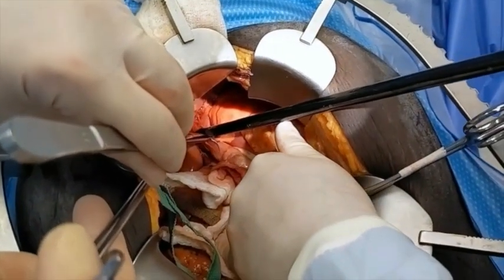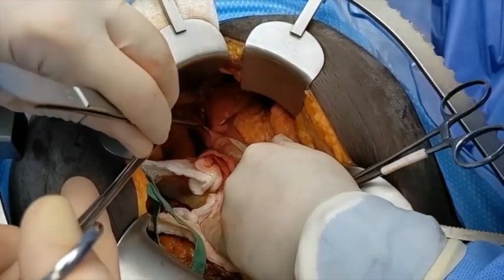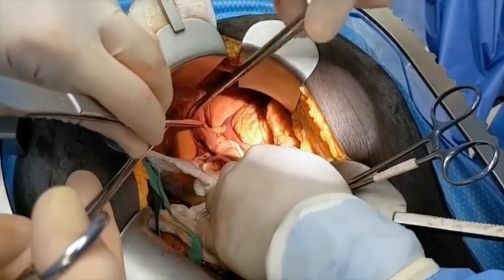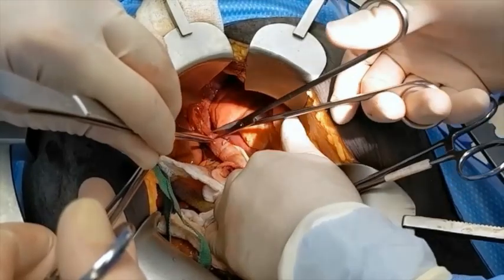of the diaphragm. The anterior vagus is carefully exposed and dissected off the distal esophagus for at least 2 to 5 centimeters. The vagus is then clipped proximally and distally, and the segment of vagus between the clips is excised and sent to pathology for immediate confirmation.